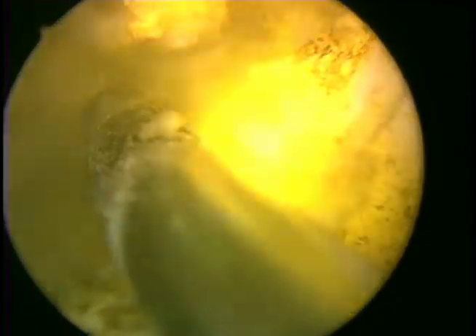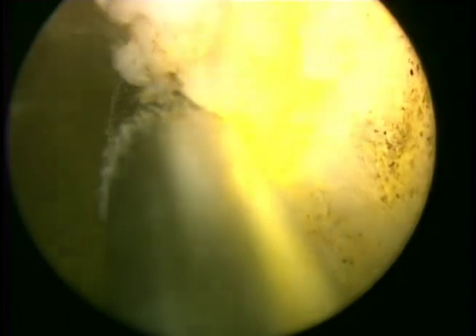It is for that reason why I think it is so important, especially for novice surgeons and even for all levels of surgeons, to pre-mark at the very beginning of the surgery in the most optimal conditions that limit of dissection in front of the verumontanum. This plays an important role in making sure that our patients remain continent after the surgery.